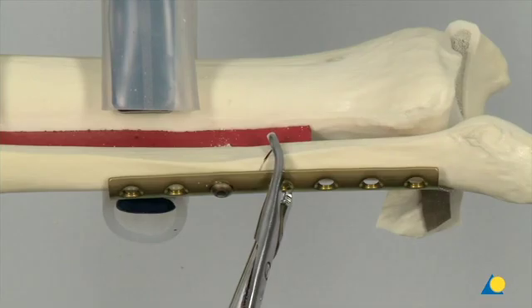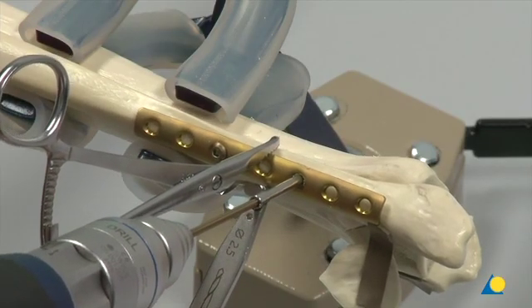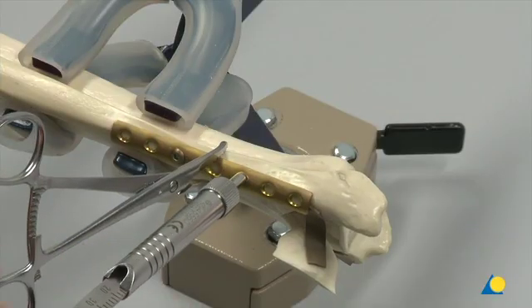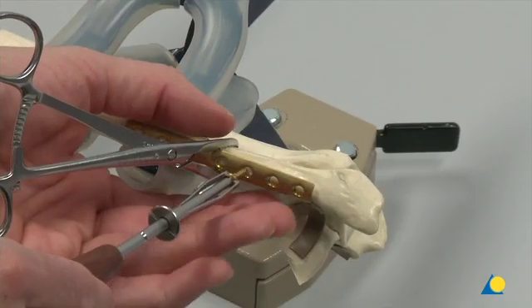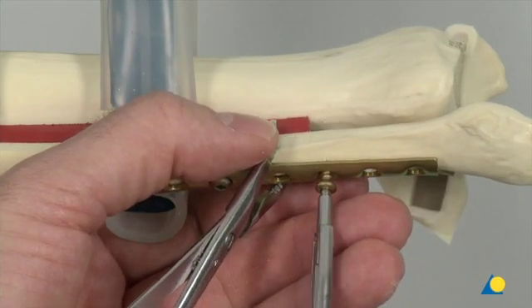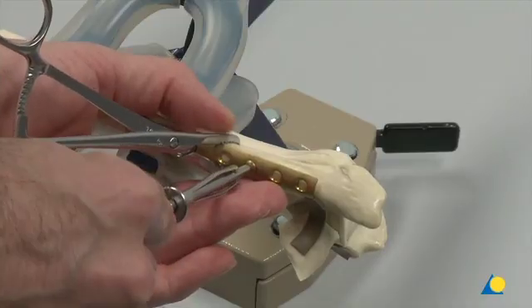The 2.5 mm drill bit is used to drill eccentrically through the third distal plate hole. The depth gauge is used to measure the required screw length. The 3.5 mm self-tapping screw is inserted into the drilled hole, resulting in axial compression. As the eccentrically placed compression screws are tightened, the head moves down the ramp in the plate hole and compresses the bone together.